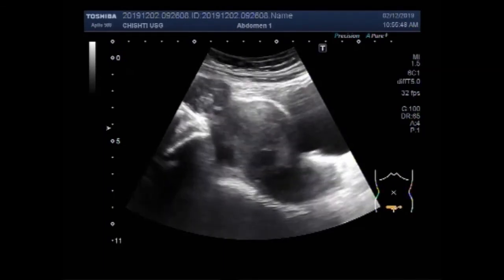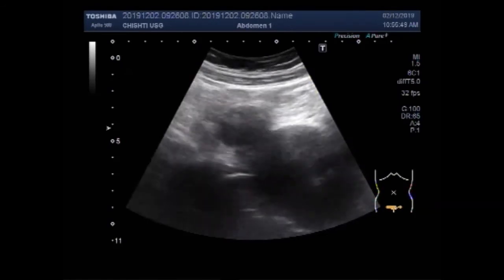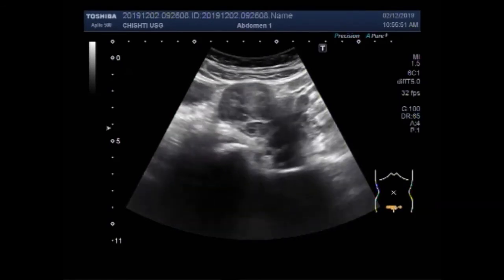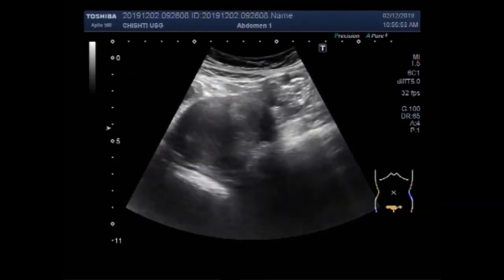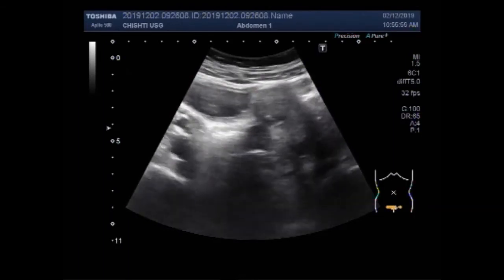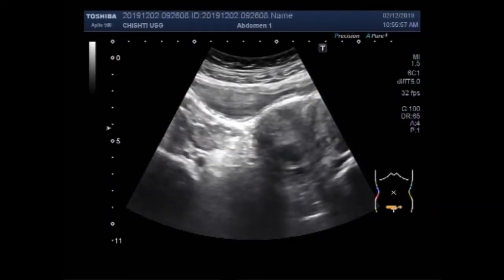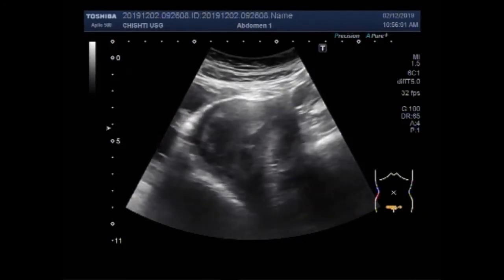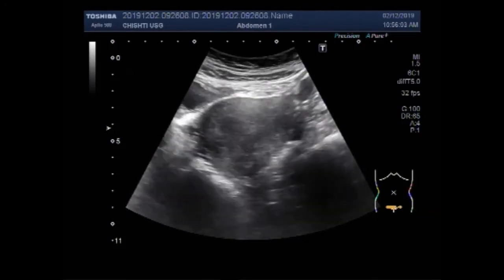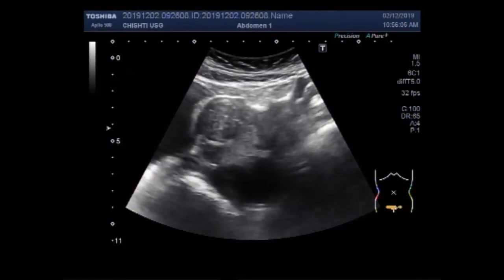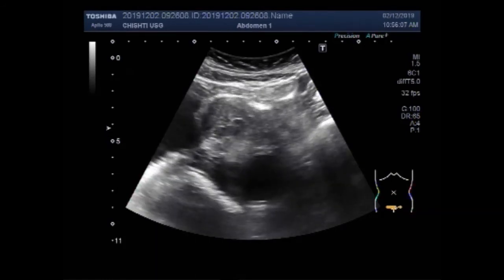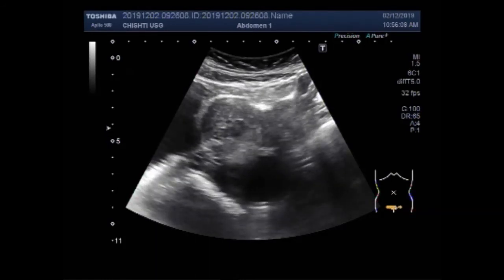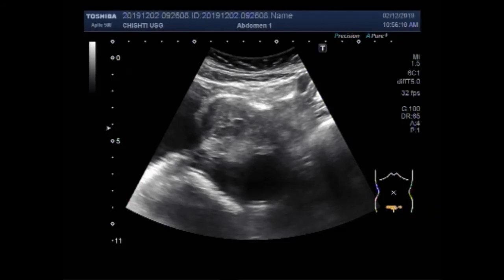Now you are going to see the right ovary. This is the right ovary — a mass is visible on the right ovary.